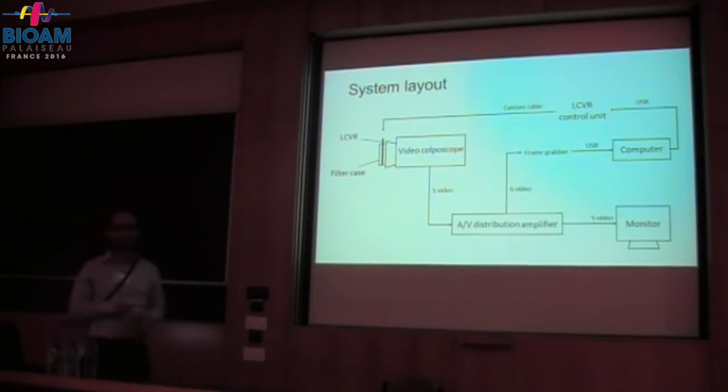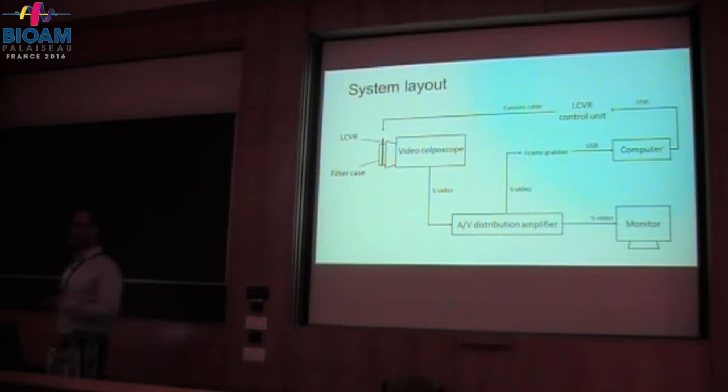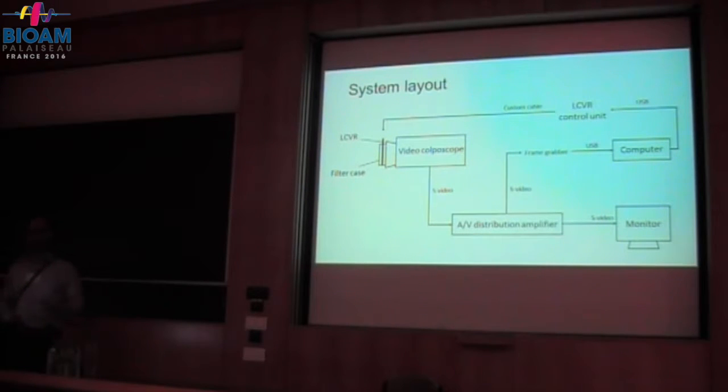This is our setup. The colposcopes are really old instruments. Something we've learned in trying to deal with them is that a lot of the colposcopes in the clinic today actually use analog technology like S-video, so a frame grabber was needed, because when we came into the clinic, our approach was that we wanted to change what the clinicians were doing as little as possible. So we actually stuck with our old instrument at the time. We realized later that actually building the colposcope from scratch was substantially easier than dealing with this analog stuff because it's just difficult to control.